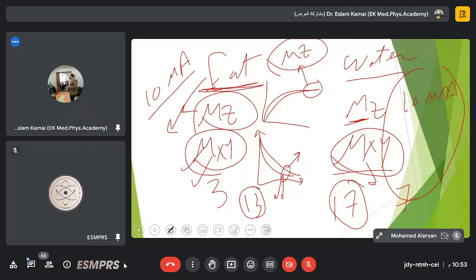That's why we have TR and TE: repetition time and echo time.